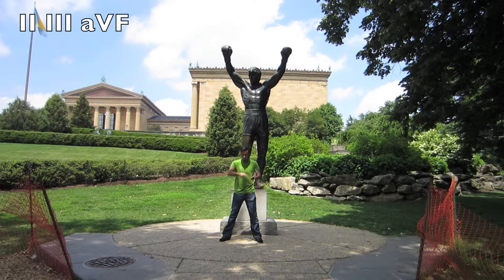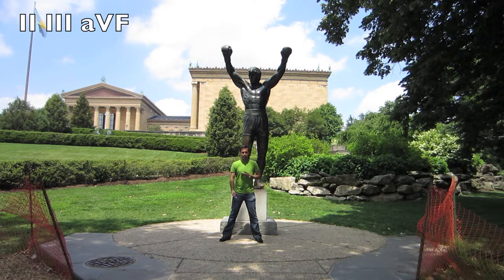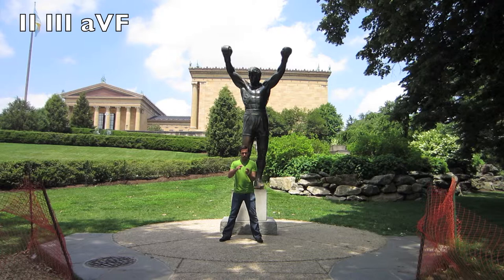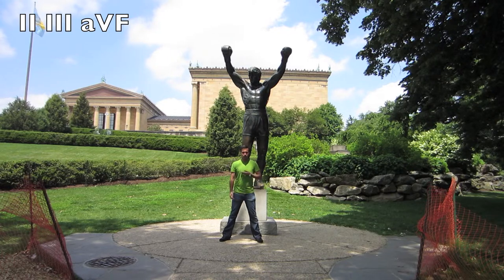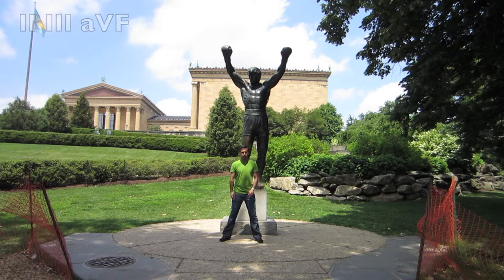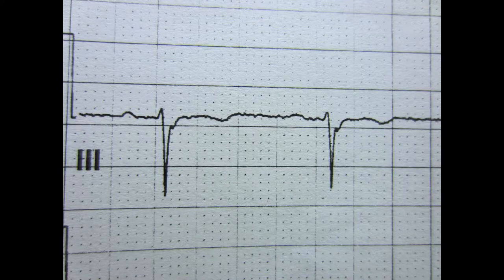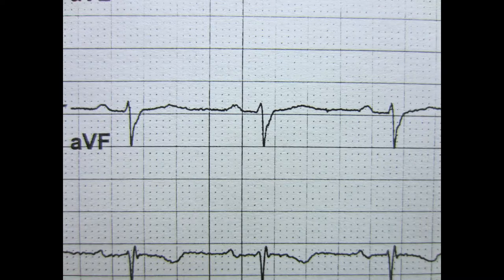Next I look at leads 2, 3, and AVF — these are my inferior leads. They typically look at the inferior portion of the heart, correlating with the RCA. No changes in lead 2. Maybe a T wave inversion in lead 3. No ST changes in AVF.